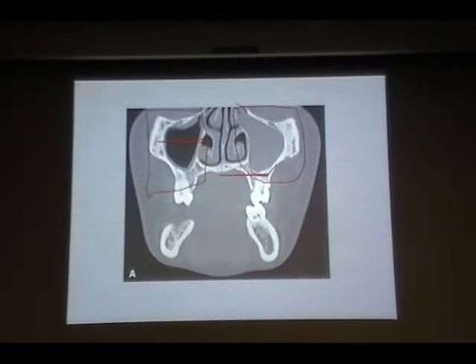You said the bone breaches in and it grows into it? No, there is no breach here in this particular instance. So the gray space is soft tissue? That's a soft tissue here.